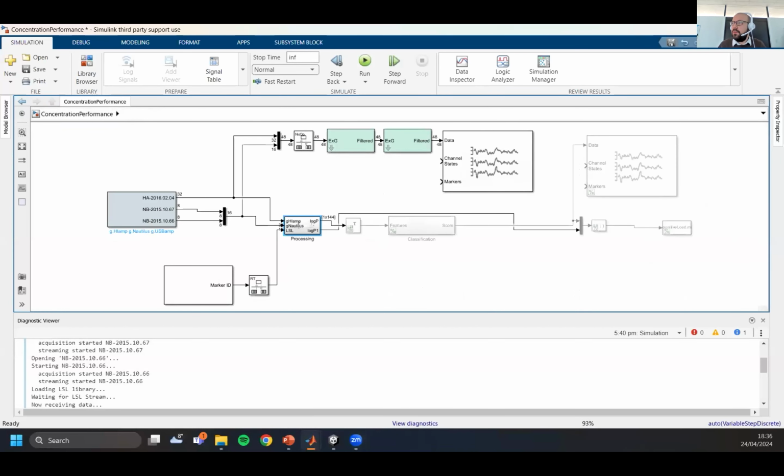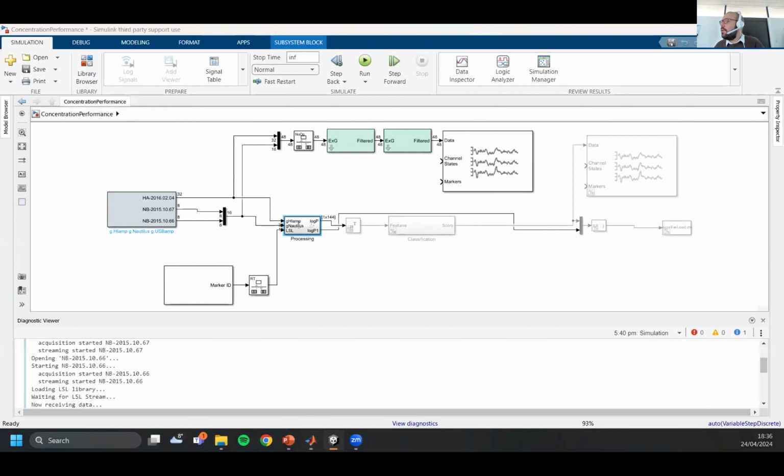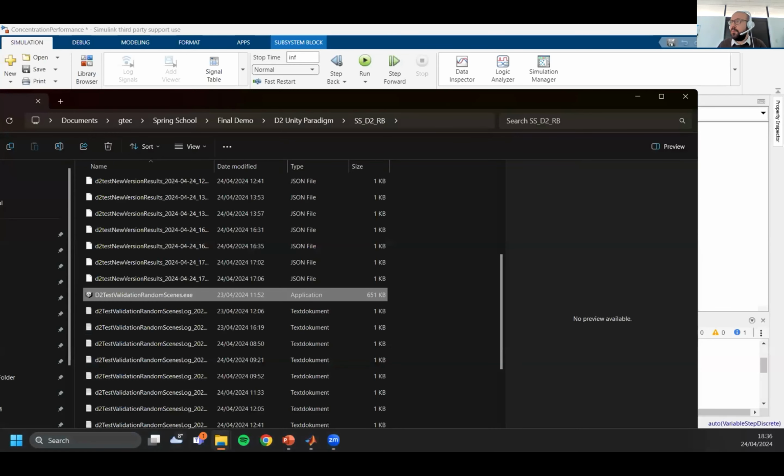I can go to the other screen. Behind the mastoid, this will be the ground. Thank you. Exactly. So I can show you, for example, on the other screen when we are running. Everything is fine. I'll have to restart the paradigm, and once we restart the paradigm, we'll basically be ready to go.